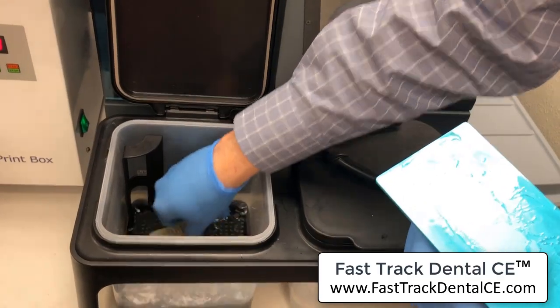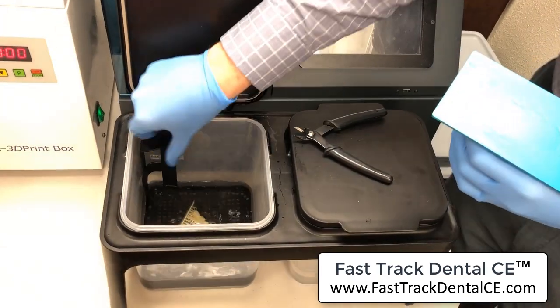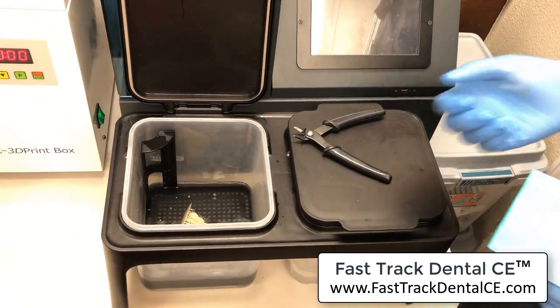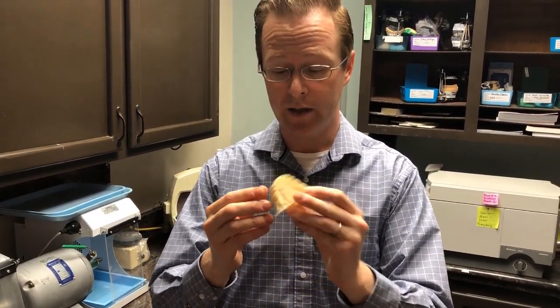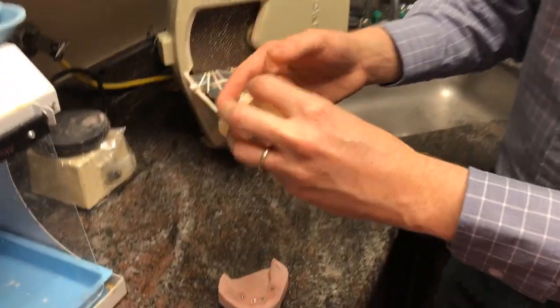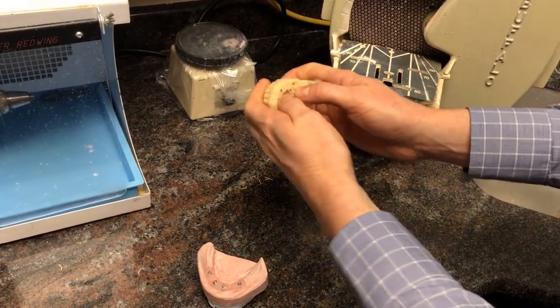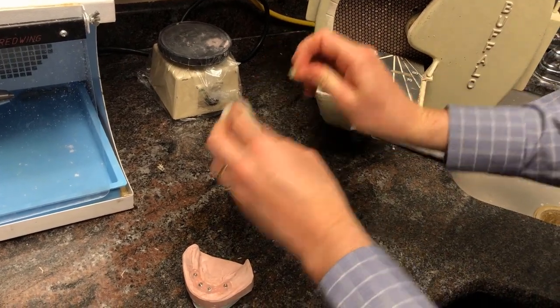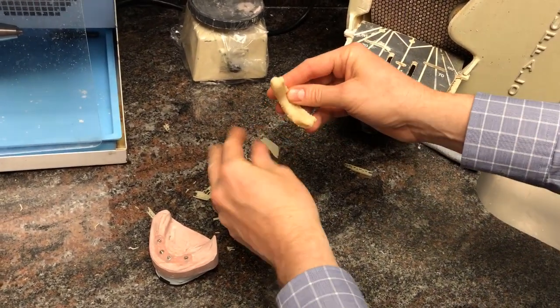I drop it right into the wash station — the same one I have for my Form 2 — and let it sit. Then I'll bring it to the model, take it to the lab bench, see how it looks and fits. I went ahead and cured my Photon print in my NextDent curing oven. Now let's remove all the supports. I've got my patient model sitting right here; I'm just going to peel and see if I can pop these off — looking pretty good!